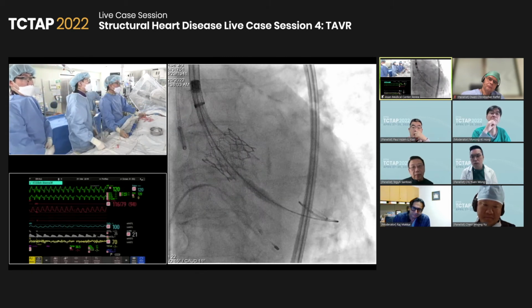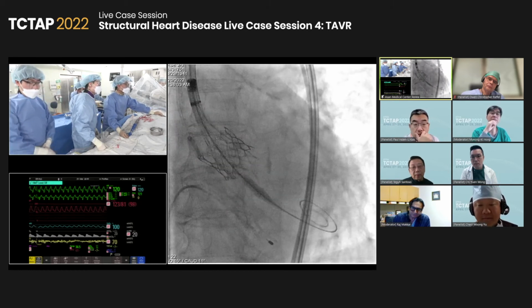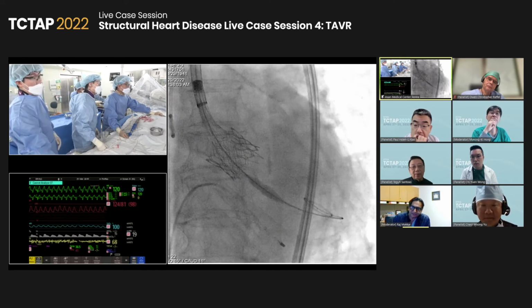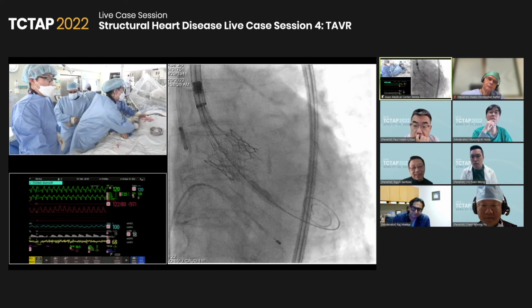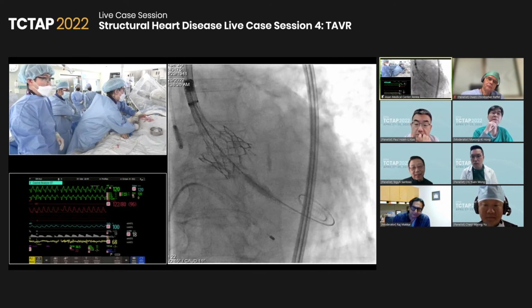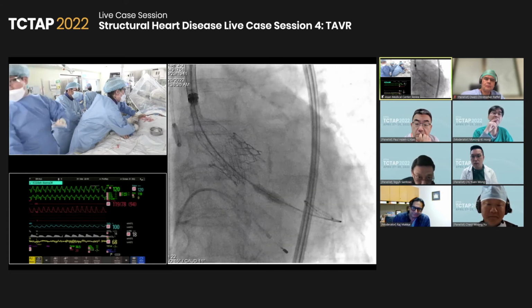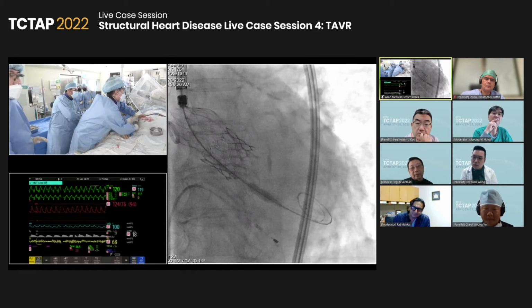Wait. Blood pressure is good. Okay, blood pressure is fine? Okay, test. And when you release it, it will tilt on the other side, on the left. Okay, let's release it now. It seems fine. Release, tension release, tension relief, release everything. Go up. Yeah, higher. Release. Okay, tension relief, full. Okay, tension relief. Everything released? Release more, all the way.